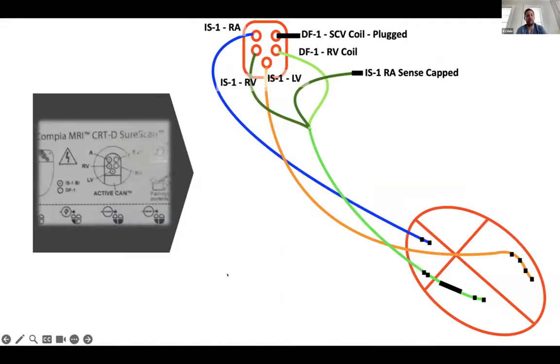Okay, so Dr. Edafe, this may look familiar. I just made a digital copy of the diagram I wrote out for you yesterday. Here is the box that Dr. Kuro and I just talked about, but it's a little hard to read, that says SVC. And yes, this is the dot that Dr. Edafe was talking about for the low voltage leads. So, a circle with a dot in the middle.